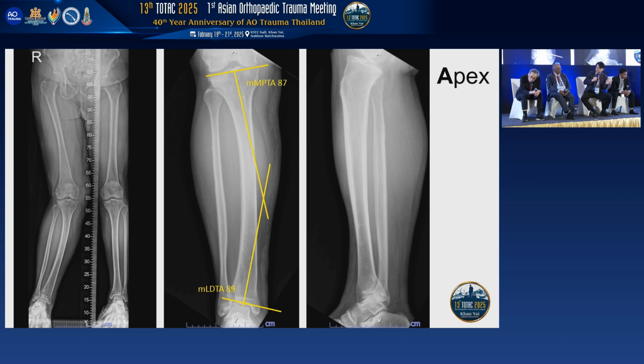at the distal femur. And on the tibia side, you can see that the CORA is outside of the bone. That means it could be more than just one location. So I will think about the possibility of resecting a segment of the bone in the middle so that I can make a good bone contact. But before I promise to do that, I will do a paper cutting, or computer simulations, to guide me. Maybe I can be guided with some PSI or something. I can make a plan on computer. So far, that's my mind.